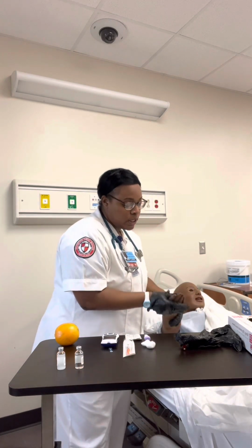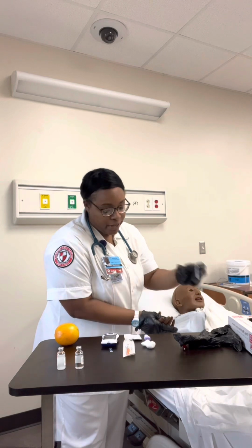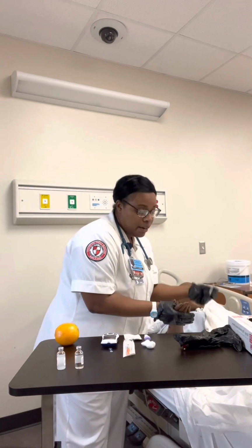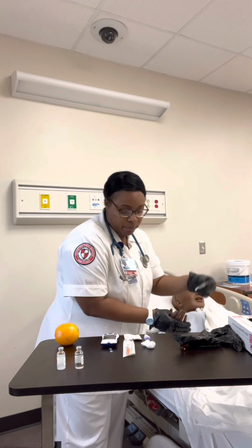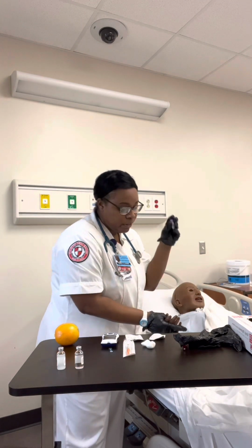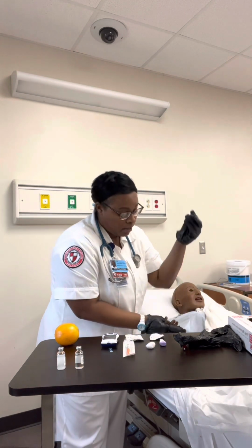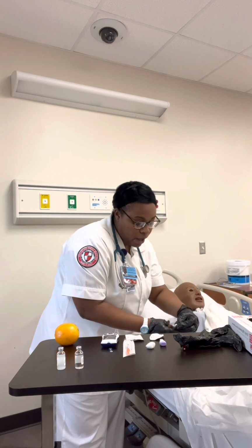I'm going to select the distal end lateral side of the finger and wipe it with an antiseptic wipe. I'm going to pierce the lateral side of the finger with a lancet and wipe the first blood with a cotton swab.